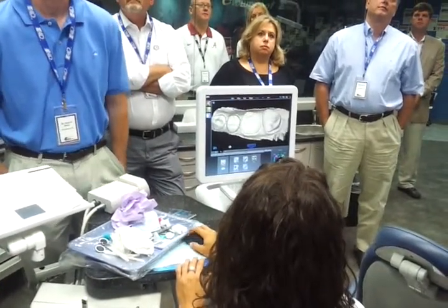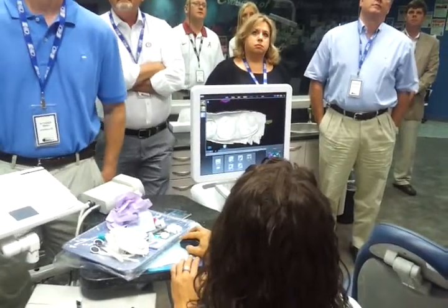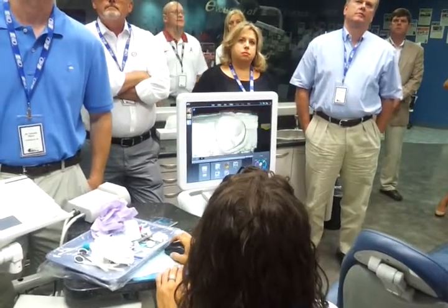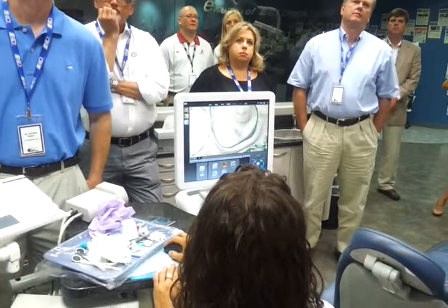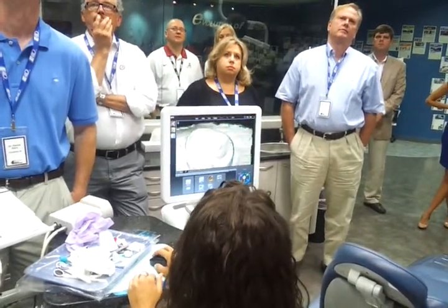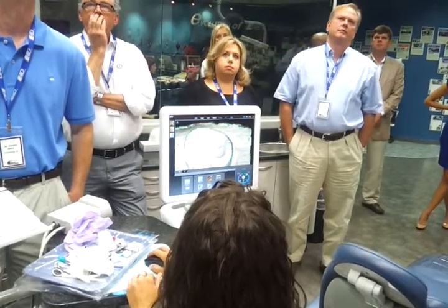I'm going to mark my margin first on tooth number 18 because that's what's highlighted. So I'm just going to rotate this using my show features, which is going to highlight my hard edge here, that hard enamel edge. I'm going to use my trace, and I'm just going to go ahead and start to mark my margin here. We have 3 different tools that you can utilize to mark margins.